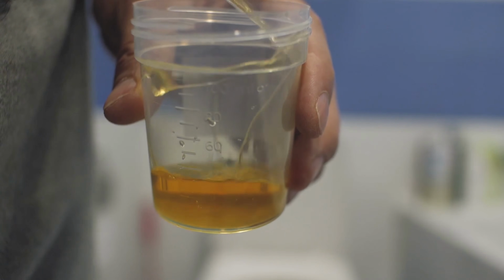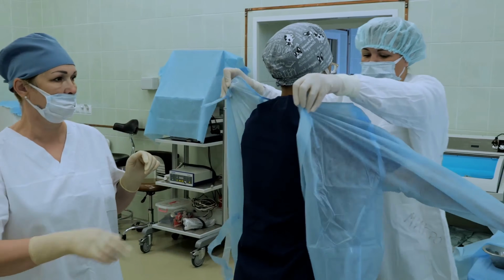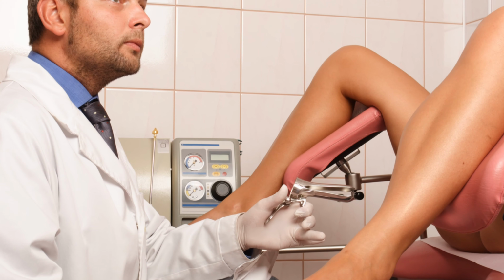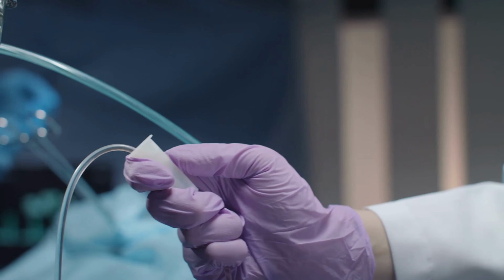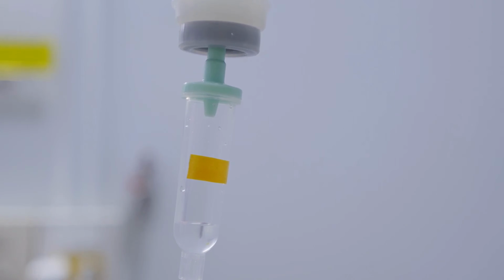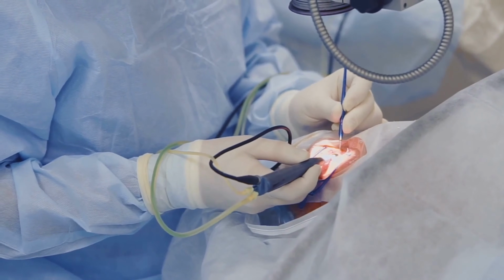Before the procedure, the patient will need to empty their bladder and possibly provide a urine sample to check for infections. During a flexible cystoscopy, the patient will need exposure from the waist down, and they will be covered with a gown. The patient is then laid down on a couch or bed. Local anesthetic gel is applied to numb the urethra. The cystoscope is gently inserted through the urethra into the bladder. A saline solution is pumped into the bladder to inflate it for better visibility. The bladder is examined, and if necessary, a biopsy can be taken. The procedure typically takes 10 to 15 minutes.